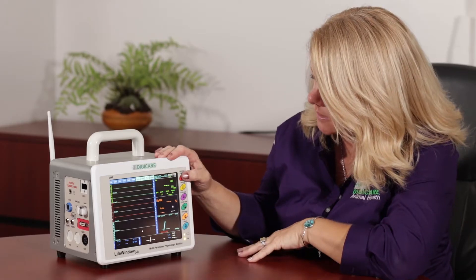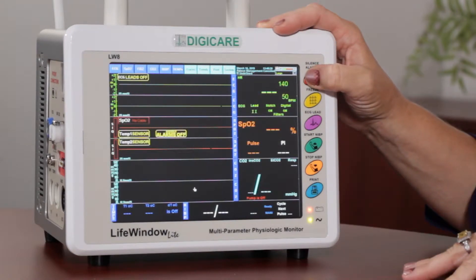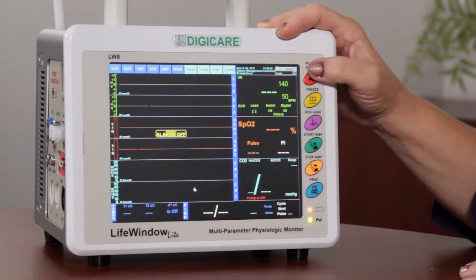On the front panel of the LifeWindow Lite, you have your silence alarm button. If you press it one time, this will silence the alarm for two minutes. If you press and hold until the audible alarm stops flashing in the center of the screen, this will silence the alarm until you press this red button again.